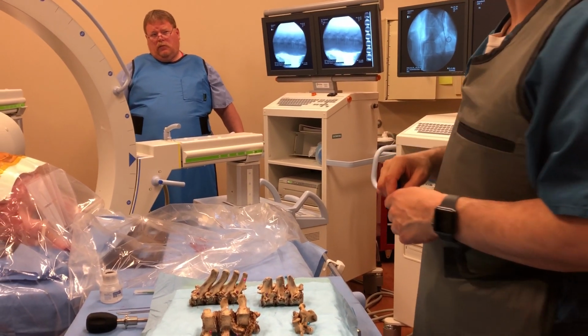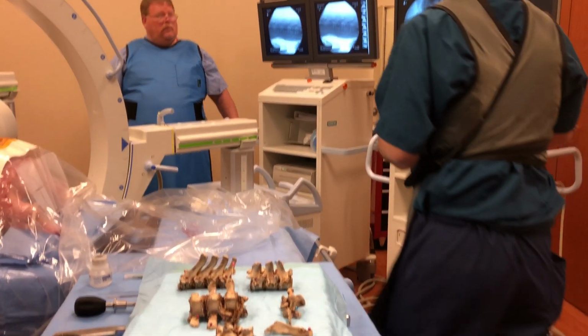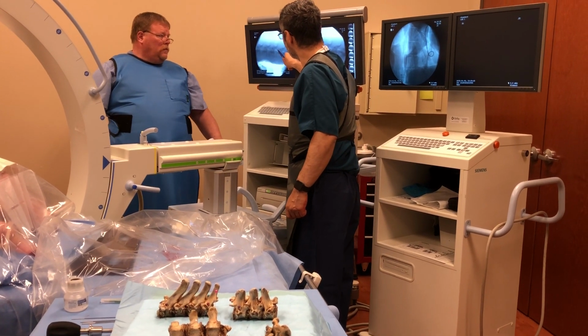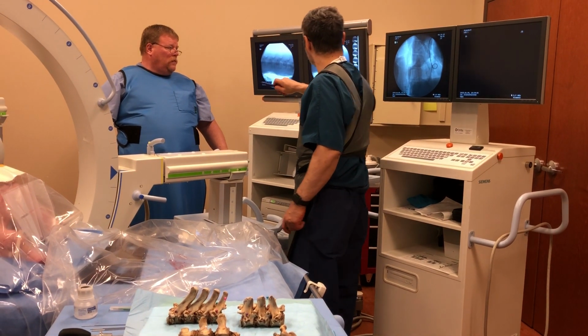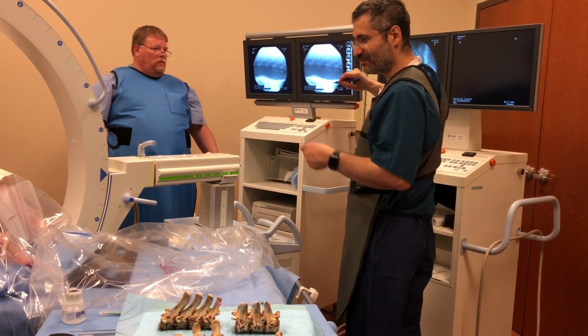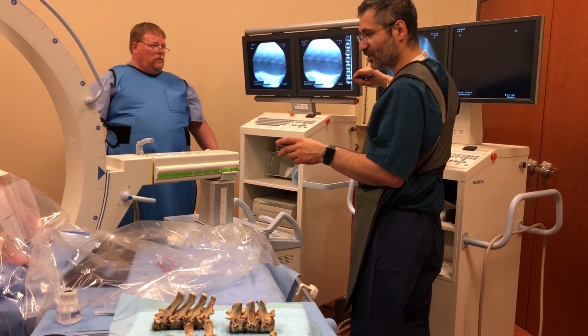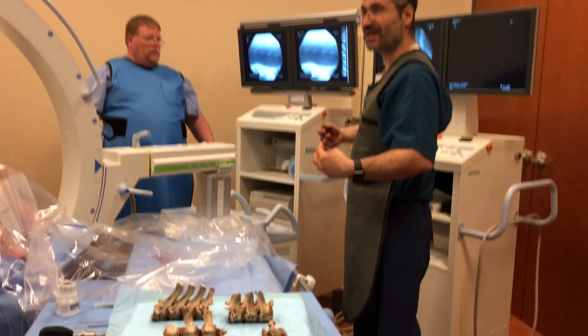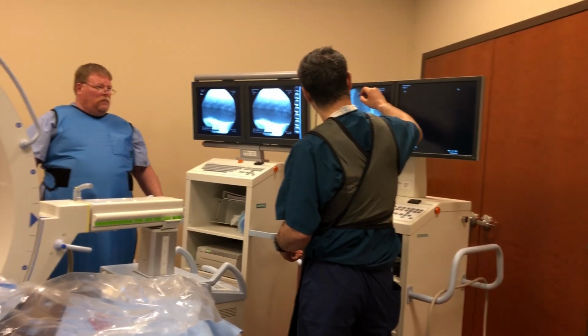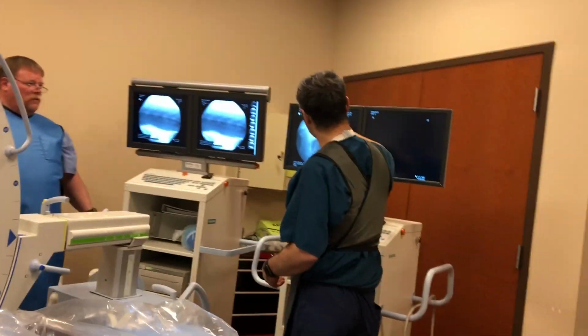The approach would work exactly the same way, where we are pointing to the pedicle, but here we have to go a little farther up, and here. Unfortunately, we have a little technical difficulty. They got the pig out, and then we have to put bags in. Usually we have a better picture, but this is the spinous process here.